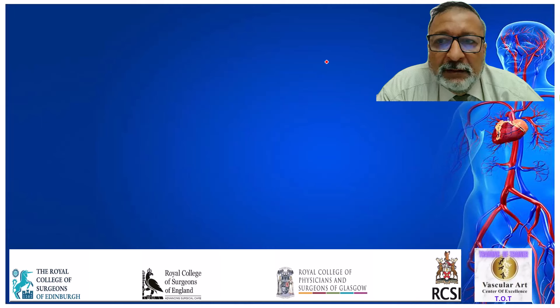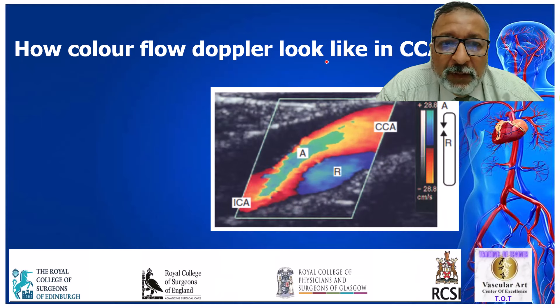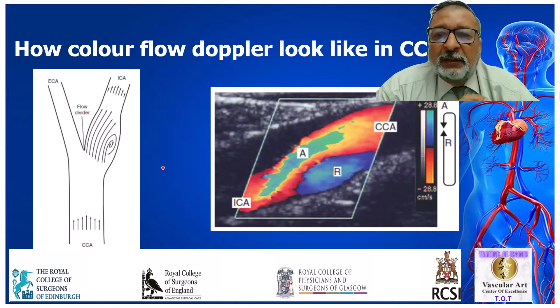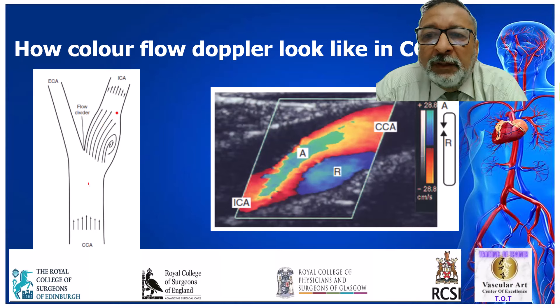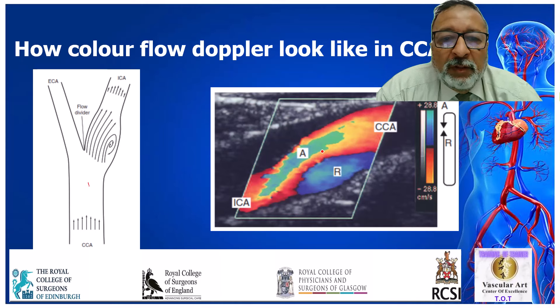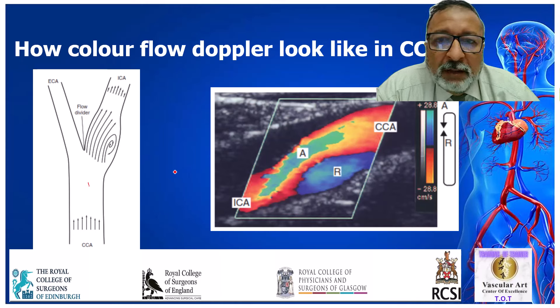Another question: how does color flow Doppler look in the common carotid artery? The common carotid artery has a special peculiarity — there is a little bit of reverse blood flow. Blood flows from the common carotid to the internal carotid artery, and you get a little bit of reverse direction at the bulb at the beginning of the internal carotid artery. You can see the blood flow in the common carotid artery in red because it is toward the probe, then becomes blue because it moves away. This is how color flow looks in the common carotid artery.